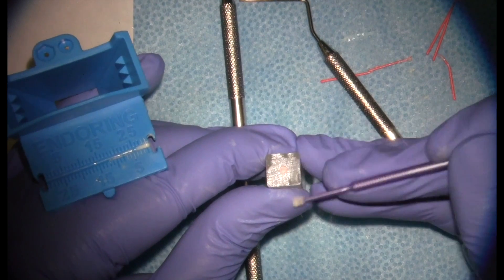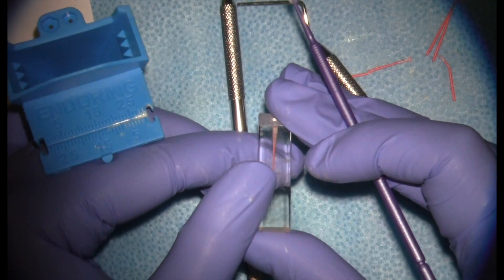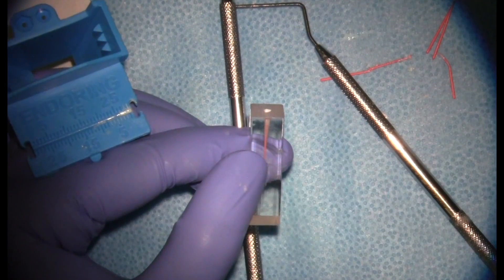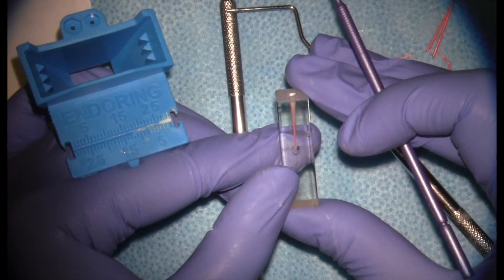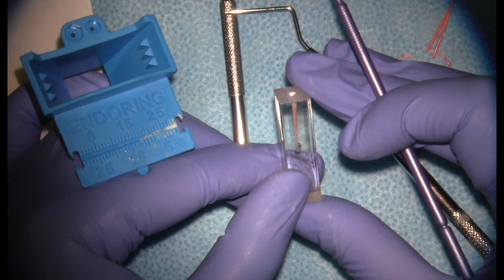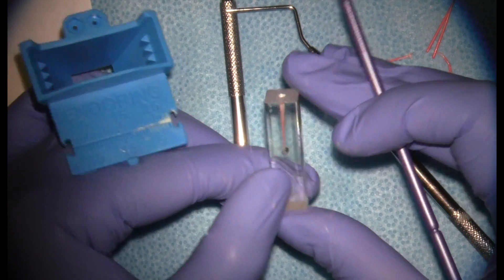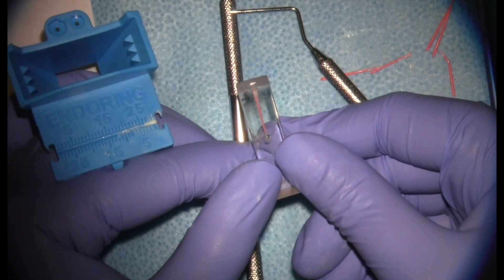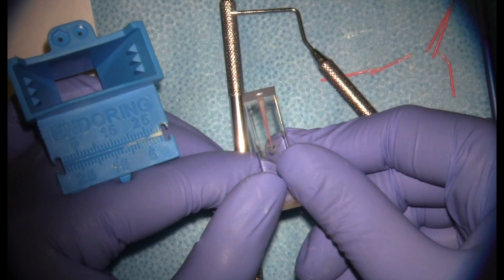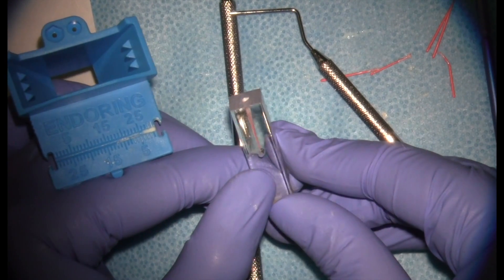That is cold lateral compaction. One advantage of this technique is that if we're not happy with our obturation at the pre-sear shot, we can pull out our cones by the tails and start over until we're happy — making it easy to improve upon before the final result. With our sear-off complete and sealer cleaned out, we'd go ahead and place our coronal restoration — either permanent or temporary — and take our post-operative images.